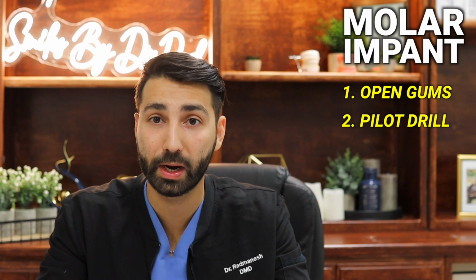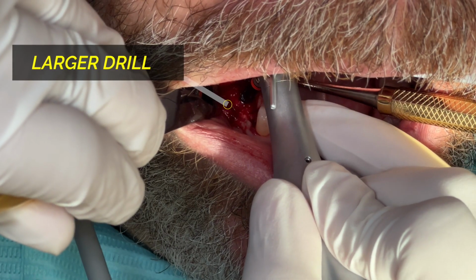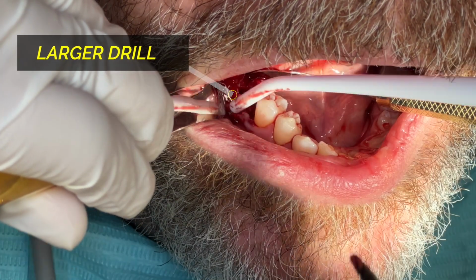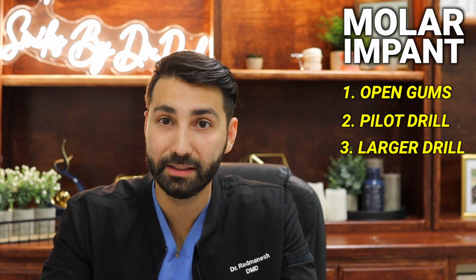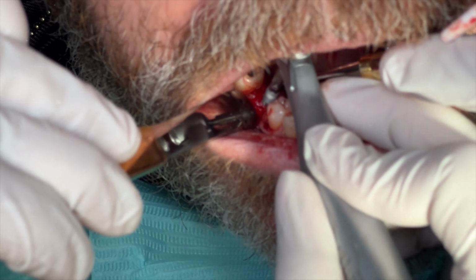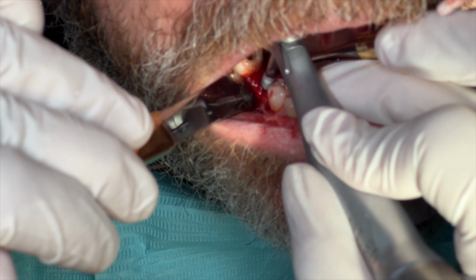Once we take an x-ray and confirm the length of the implant that we want to place, we go ahead and increase the size of the drill to help accommodate for the larger implant that we can place in this area. Once we're able to create the exact dimension of the hole that we need to place the implant, we go ahead and place the implant. And this is the video of us placing the implant on this lovely patient.